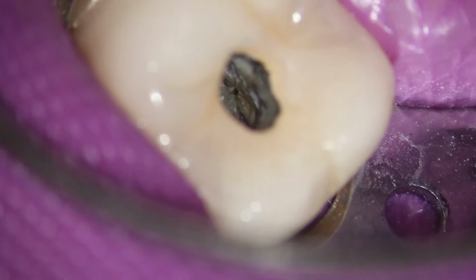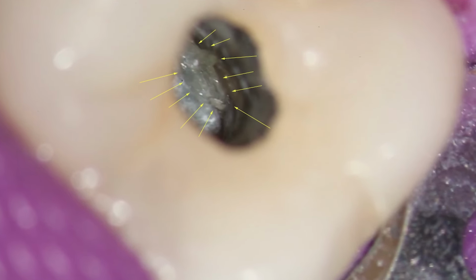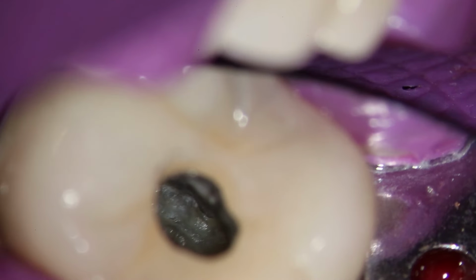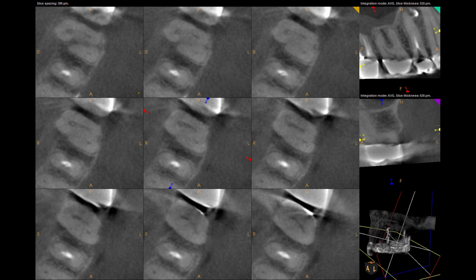And we just go in with the ultrasound, and I can actually see where the calcified pulp is after having cleaned it up a little bit. And now there's no guesswork really being done. I know exactly where it is, and I just trough back and forth. The whole time, Joy has not had to keep my mirror clean at all.